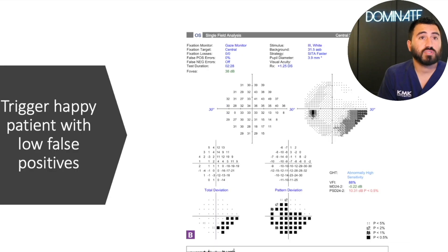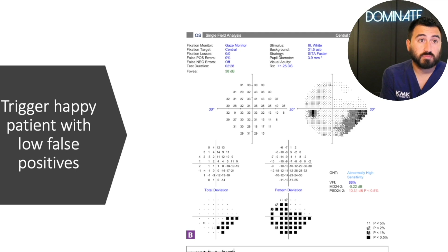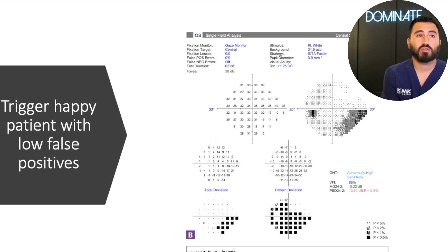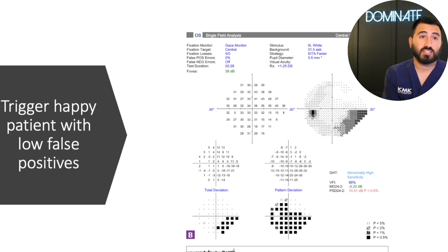Here's another example of a patient who has more spots on the pattern deviation compared to the total deviation. But interestingly, if you look at false positives — zero percent. So false positives is just one index that can tell us if somebody is trigger happy.